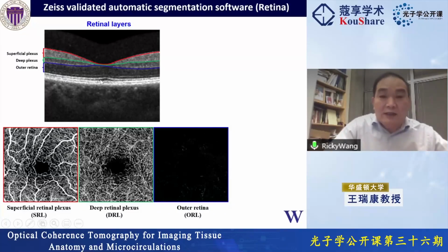In this part, in the normal eye, you do not have any blood vessels. Therefore, this layer is black. This layer is actually very important because in the diseased eye, you will have new blood vessels growing in the retinal layer, and this layer can be used to look at the new blood vessels for the diagnosis. Okay, so that's the 3 layers.